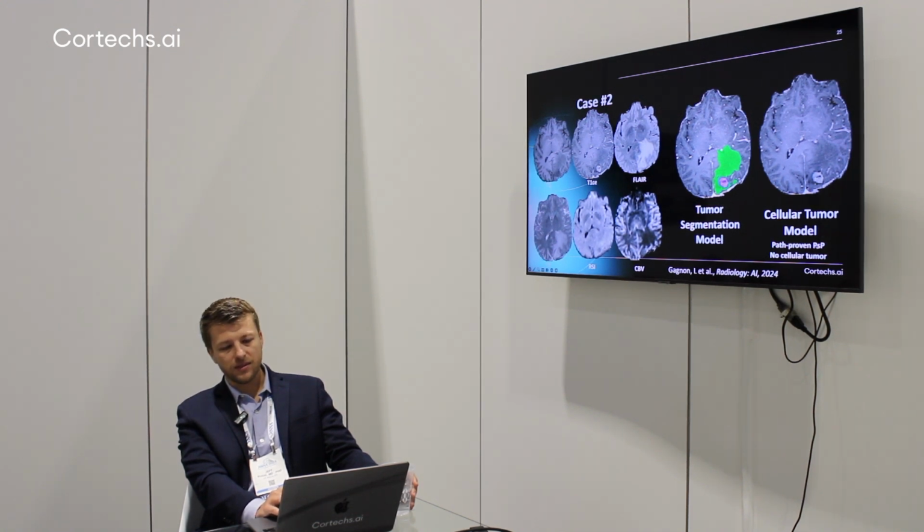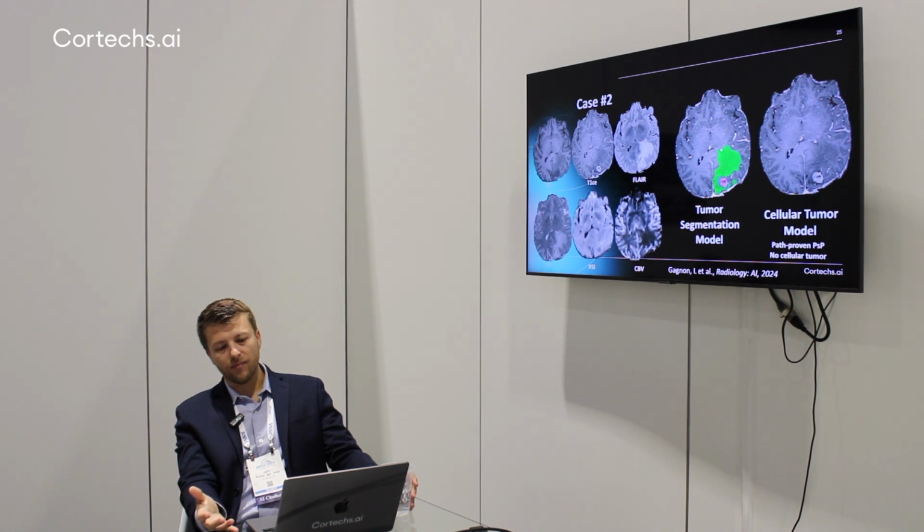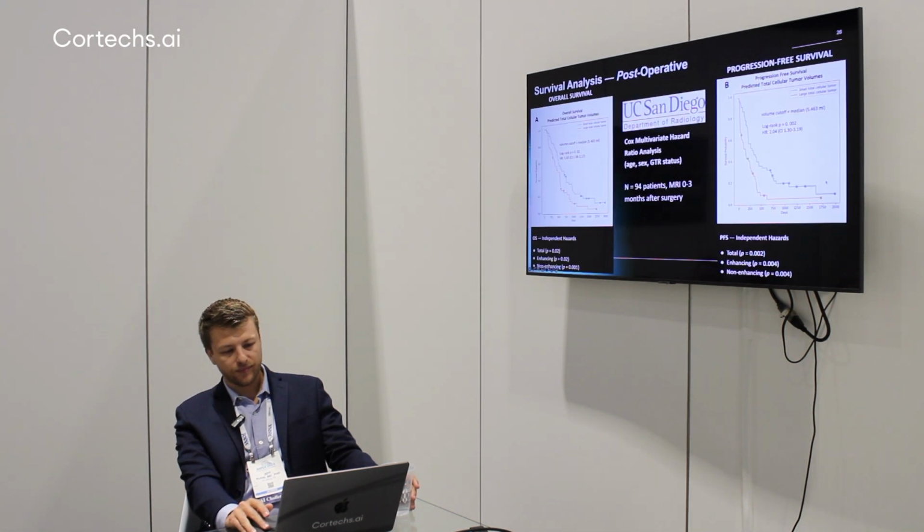So in some cases, the patients will get treated with temozolomide and radiation, and the brain will become inflamed as sort of an inflammatory response. But knowing that it's actually just a case of pseudoprogression is quite useful for preventing the patient from going back and getting more surgery. If you go back to the original data itself, you can see that the RSI map, it's not cellular, there's not a lot of blood perfusion. So if you're really trying to only predict areas of true cellular tumor, this model was able to distinguish that.